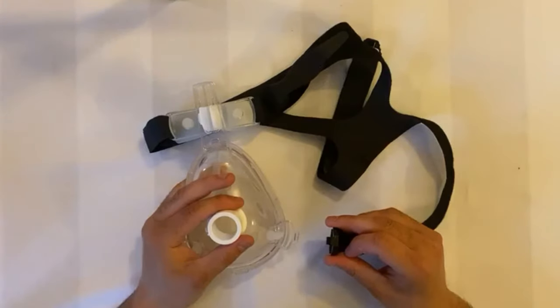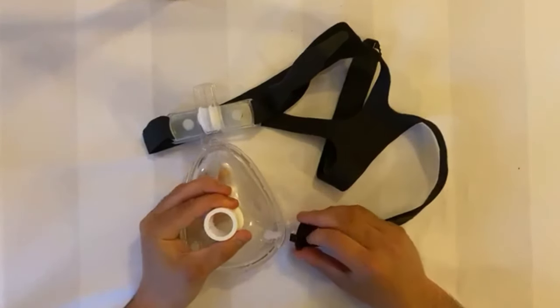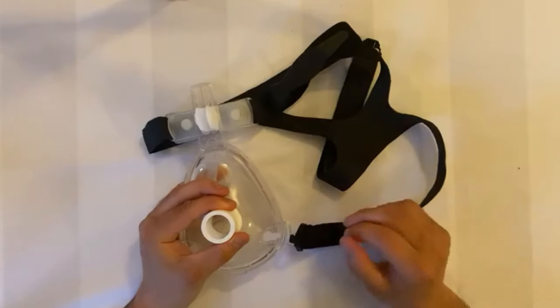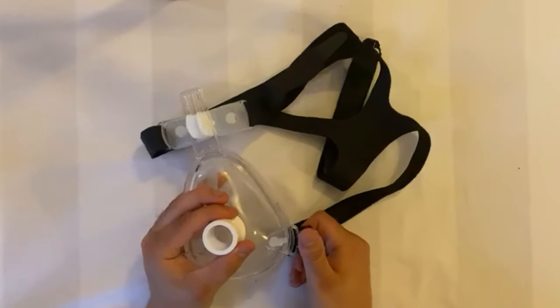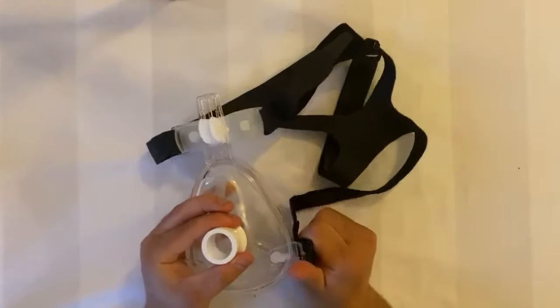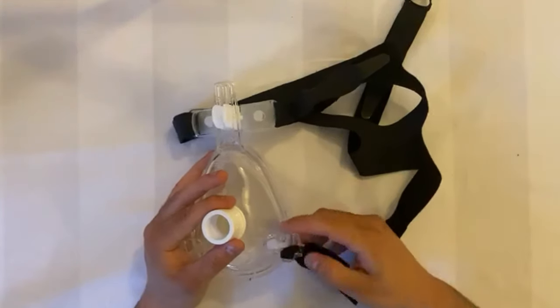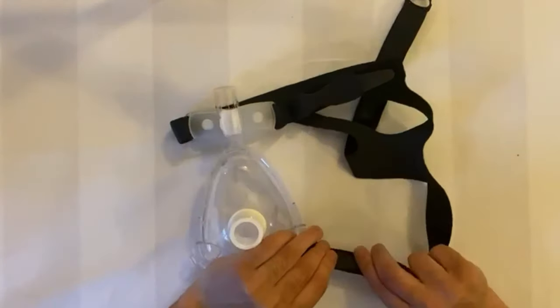To attach the headgear to the bottom of the mask, place the clip to the angle shown and push down on the top to lock it into place — you should hear a small click when attached. To remove, simply bring the clip to the same angle it was attached, place your thumb on top, and turn towards yourself in a key-like fashion. If a clip is ever lost, simply pull the strapping through the loop on the mask and use the velcro tab to stick it back down.